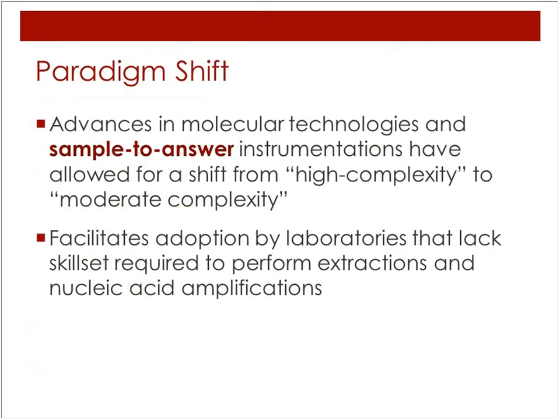In the past few years, there have been significant advances in molecular technologies, particularly with the availability of sample-to-answer instrumentations that have allowed for the shift from high complexity molecular testing to a more moderate complexity testing that can be adopted by multiple laboratories that lack the skill set required to perform traditional nucleic acid amplification and extraction. This is extremely important since there are many labs that do not have the personnel and administrative support nor the infrastructure support to perform complex molecular testing.